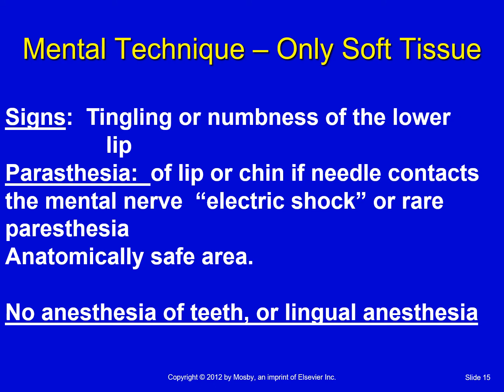But this electric shock just feels like a second, if that much, maybe even half a second, that you feel this little zing, because your needle has just passed slightly by it and kind of grazes it. It doesn't go into it.